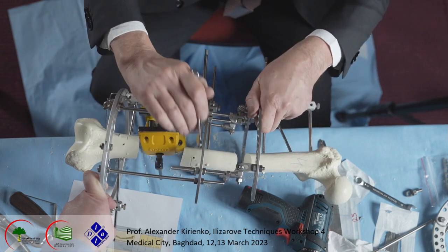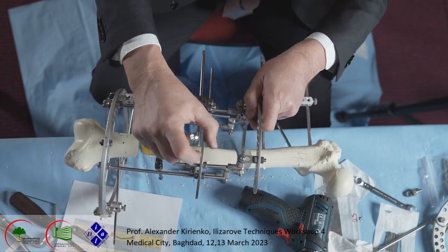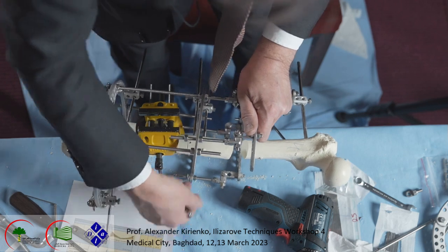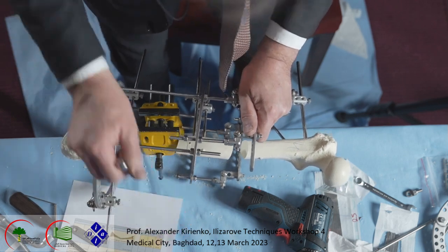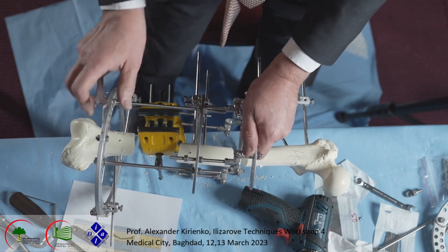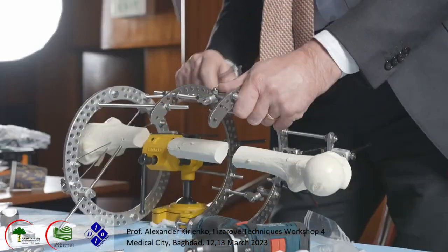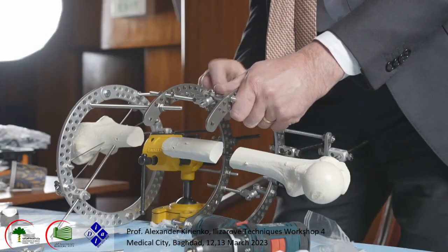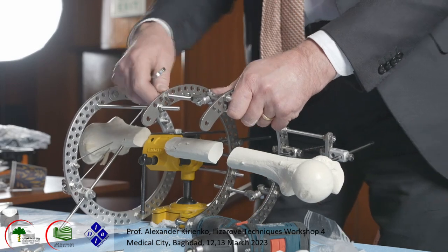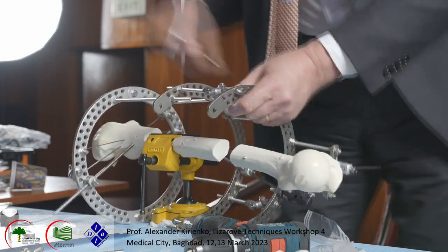I show you how it may be, practically, like this. All these hinges should be free.